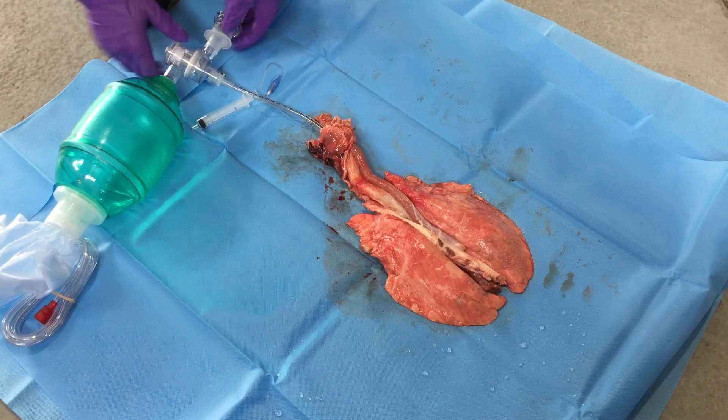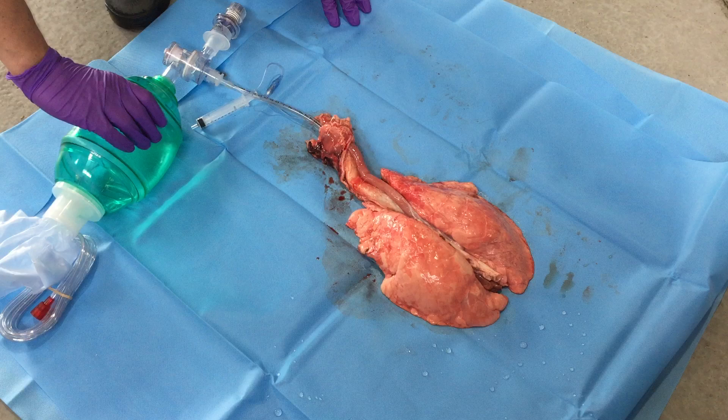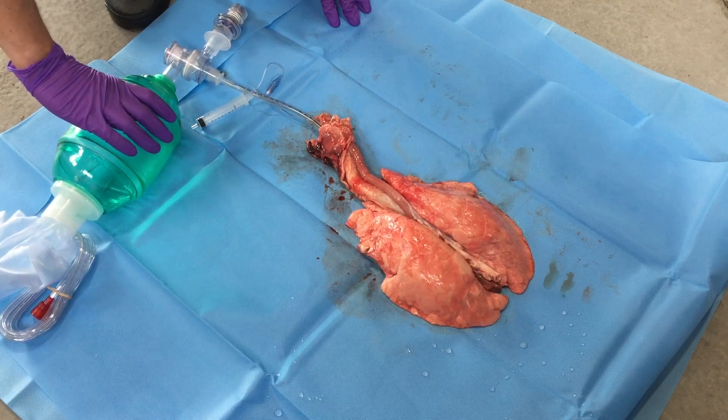Now we add a PEEP valve set to a PEEP of 10 and we start ventilating. We notice we end up with much different deflation at the end of those breaths.